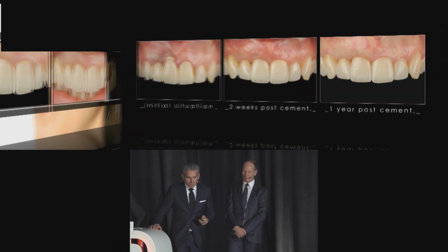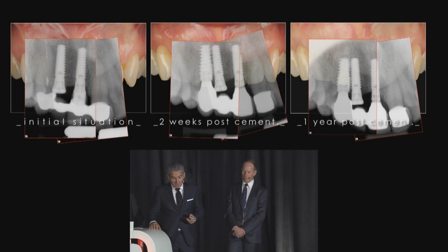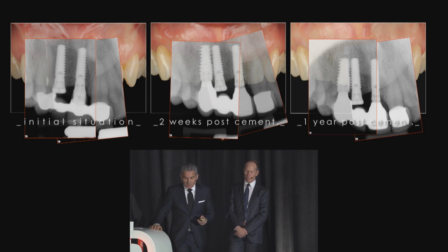This is the initial situation, 2 weeks, and then 1 year after, with the corresponding X-rays. Everything has been really stable, nothing has moved.